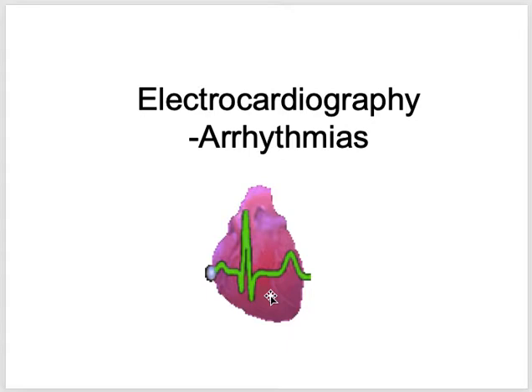If you have seen someone who has cardiac arrest, they use defibrillators, giving electric current on the chest so that the heart should come back to its normal rhythm. So there are some rhythms which are shockable, in which we can use that shock, and some which are not shockable. Of course, the most important thing is to identify if the rhythm is shockable or not.